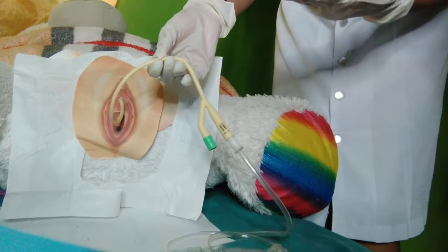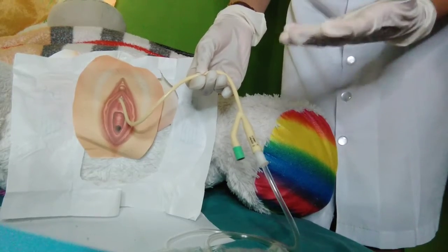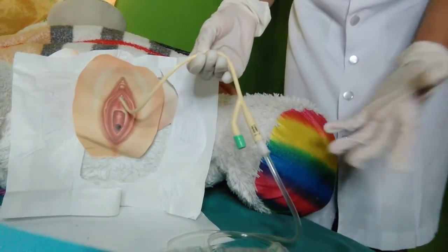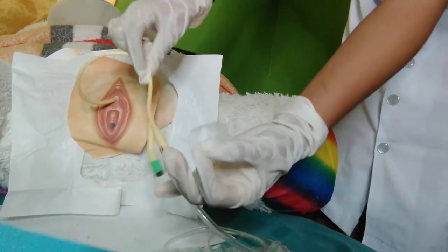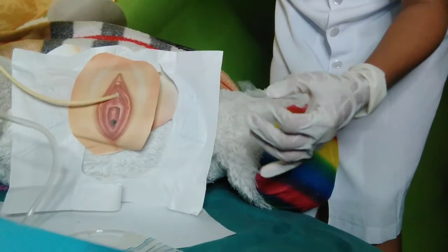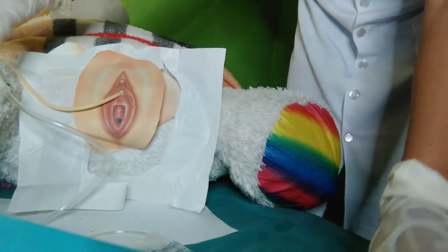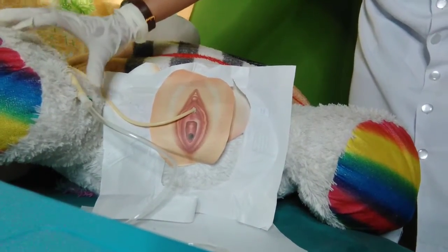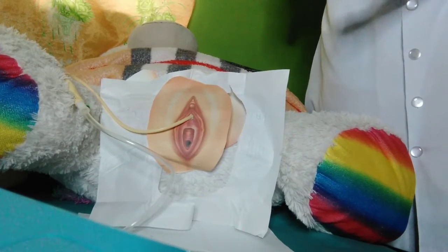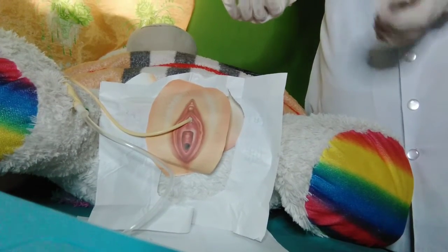So secure the catheter to the patient's leg using the securement device at the tubing just above the catheter bifurcation. Securing the catheter reduces the risk of urethral erosions and accidental catheter removal.